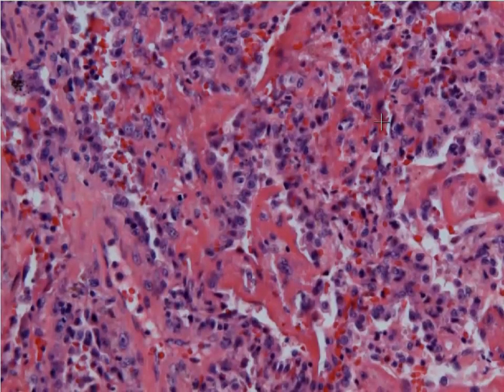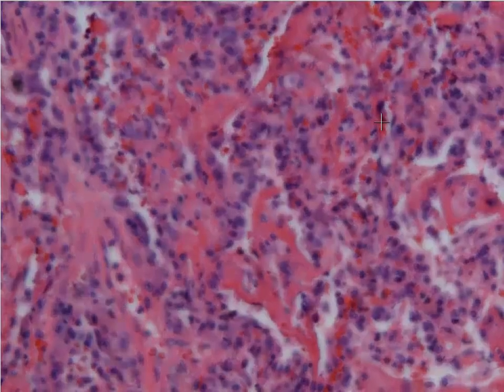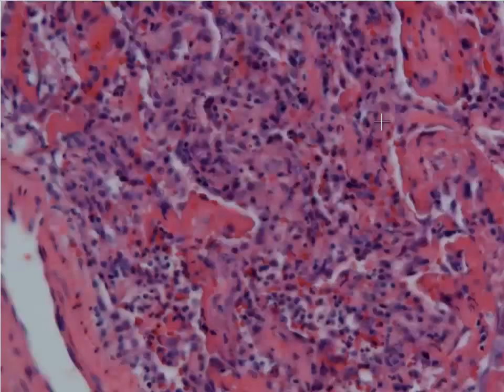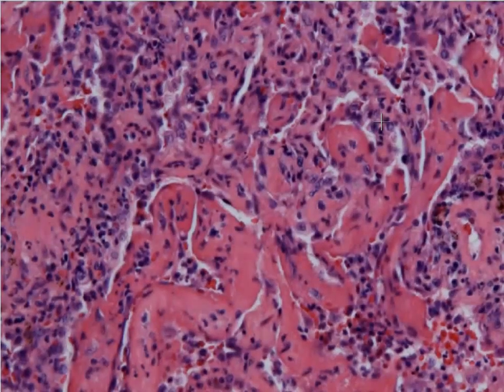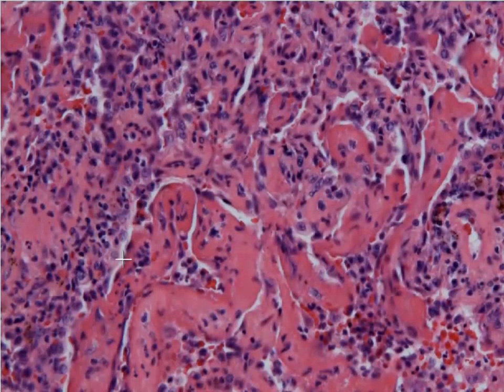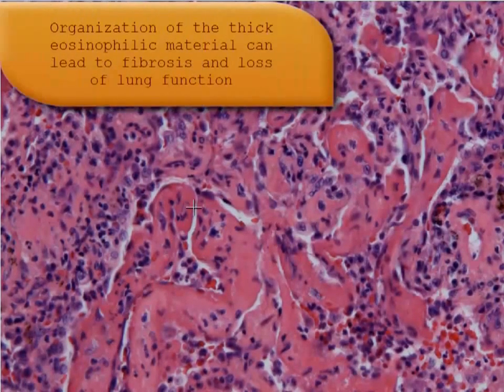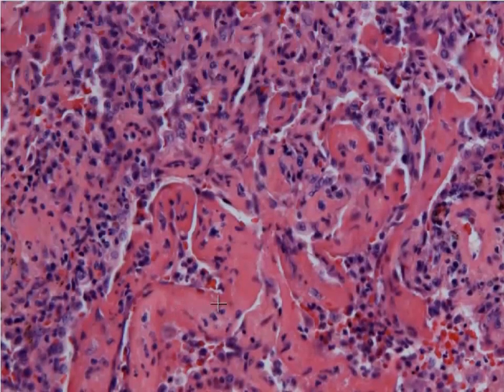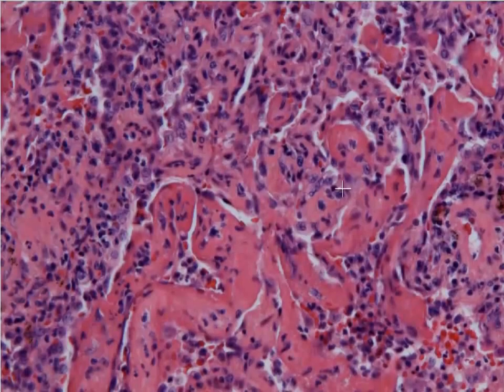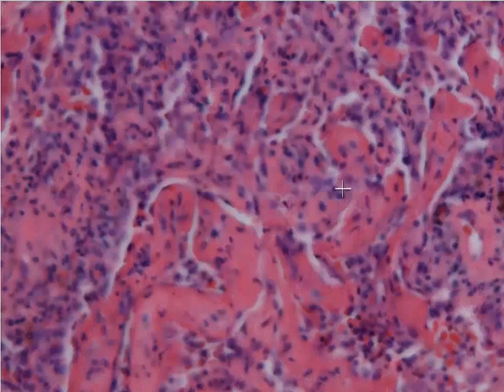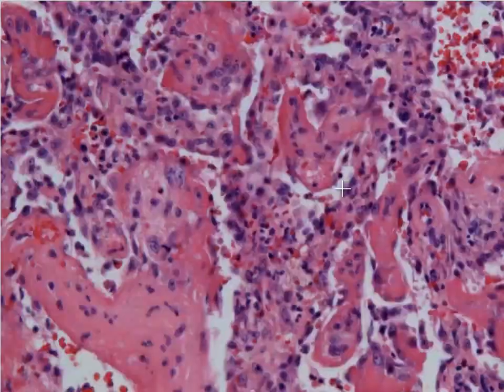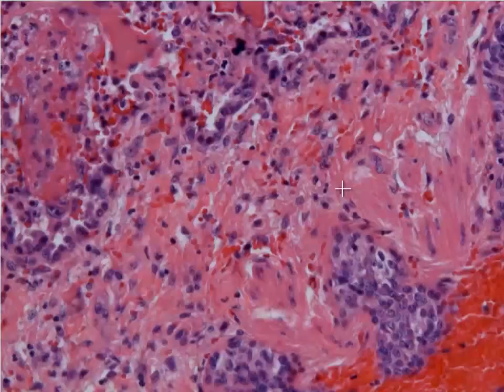Most of the time we don't see that, because the patient comes to our attention early on in the course of the disease before those hyaline membranes have formed. But you can see within this alveolar space that there is this thick eosinophilic material composed of proteins and inflammatory cells that will later organize into the hyaline membranes you see in the textbooks.